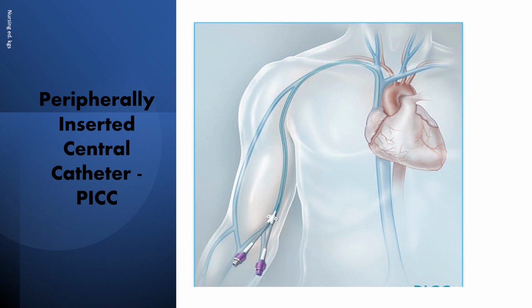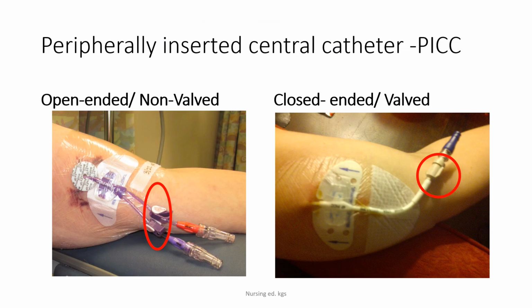These catheters will measure approximately 40 to 60 centimeters, but they are normally individually sized once they are inserted. PICCs are ideal for patients who require IV therapy for more than 6 days. However, they can last for up to a year, bearing in mind that they do also carry the risk of bloodstream infections.